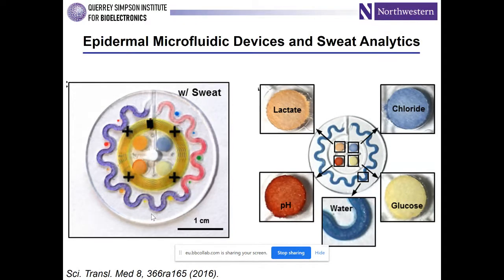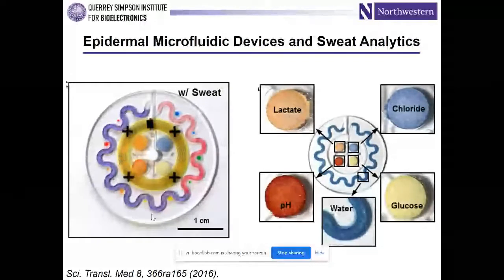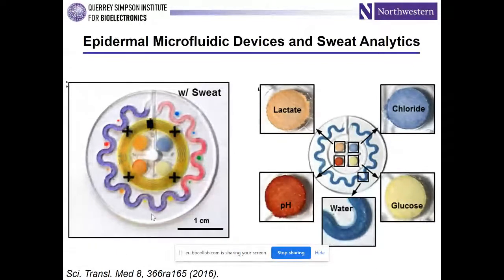There we have 5 inlet ports in this case. One connects to that serpentine channel that's running around the perimeter of the device. In that case, we have a cobalt chloride doped hydrogel that undergoes a color change when exposed to water, from purple-blue to red. And so just by visualizing the device, you can identify the fill front by the color change interface. From the geometry of the channel and the size of that inlet port, you can determine the total sweat loss, and if you know the timing, the sweat rate associated with that small region of the skin. And it turns out that local measurement of sweat rate and sweat loss correlates and calibrates to full body values. It's very important, but that can be proven out. If you know where the sweat patch is located, you can determine total body values.